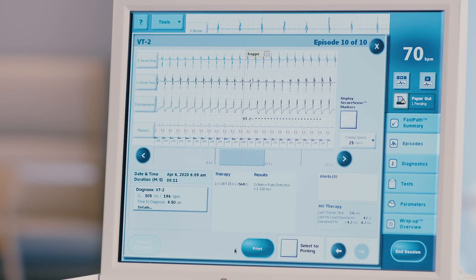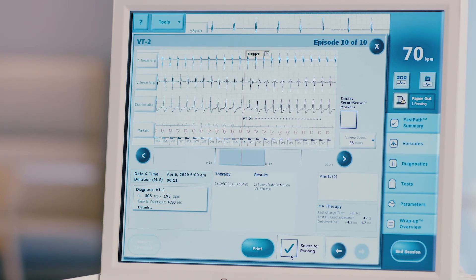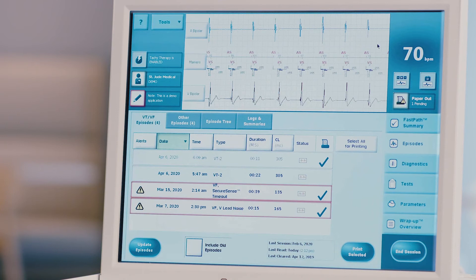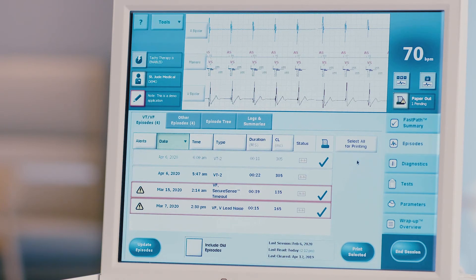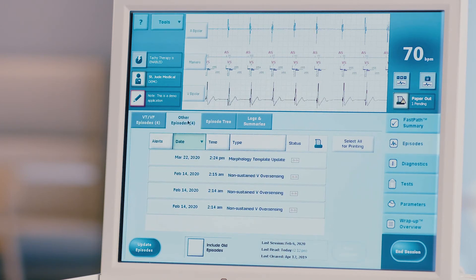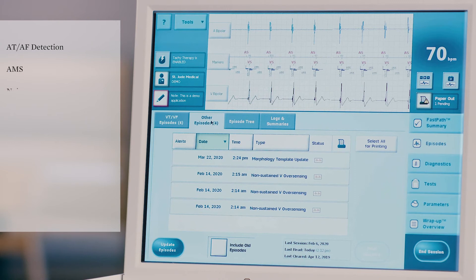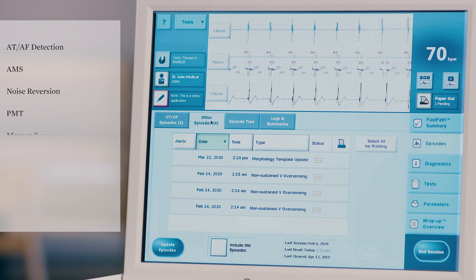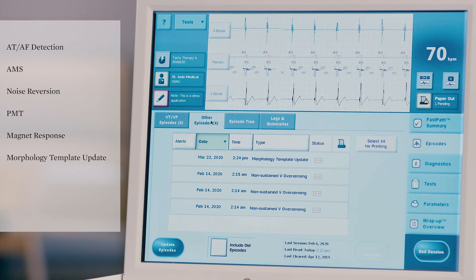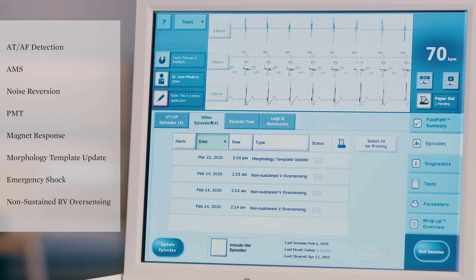You can choose to print this episode now by pressing the blue print button. You can also select this episode to be printed later by checking the select episode for printing box at the bottom of the screen. Press X to close the screen. Note that certain episodes will be pre-selected for printing. Repeat these steps for all relevant episodes listed. Choose the other episodes tab at the top of the screen to review all other types of episodes recorded by the device. These include AT/AF detection, AMS, noise reversion, PMT, magnet response, morphology template update, emergency shock, and non-sustained RV oversensing.